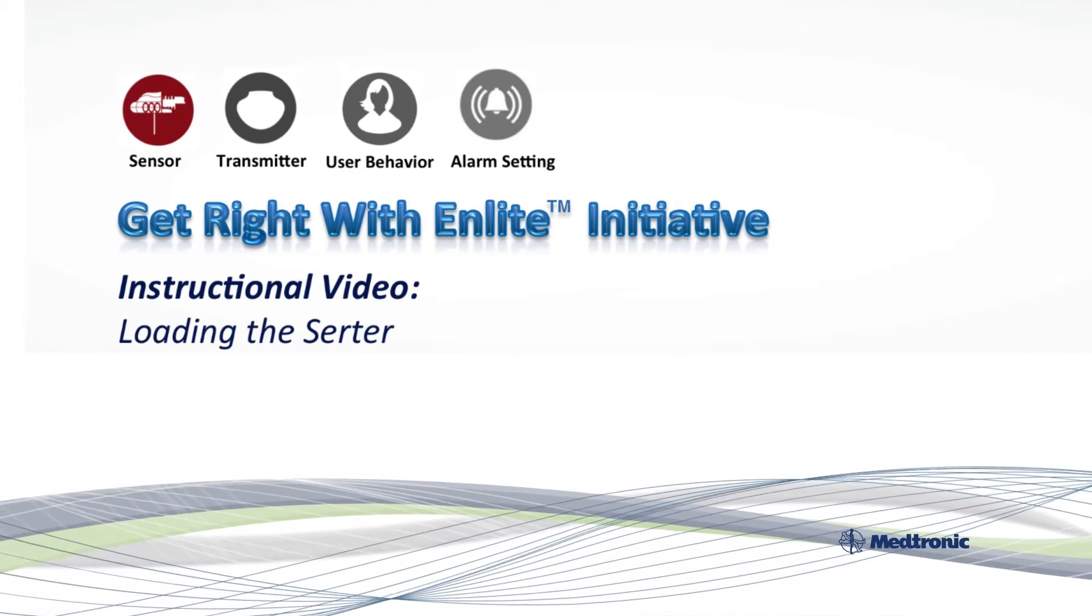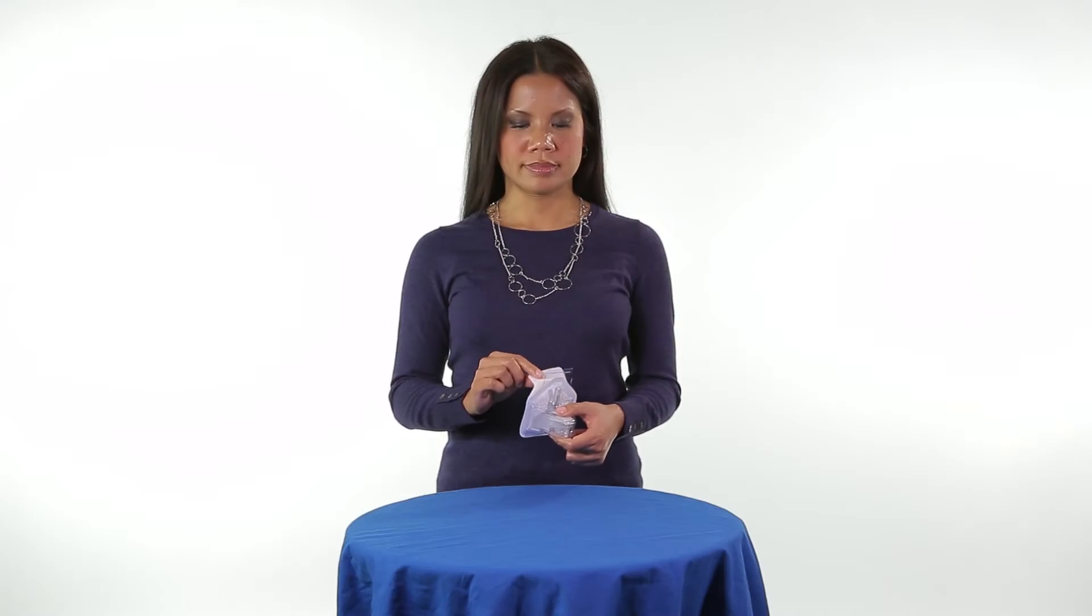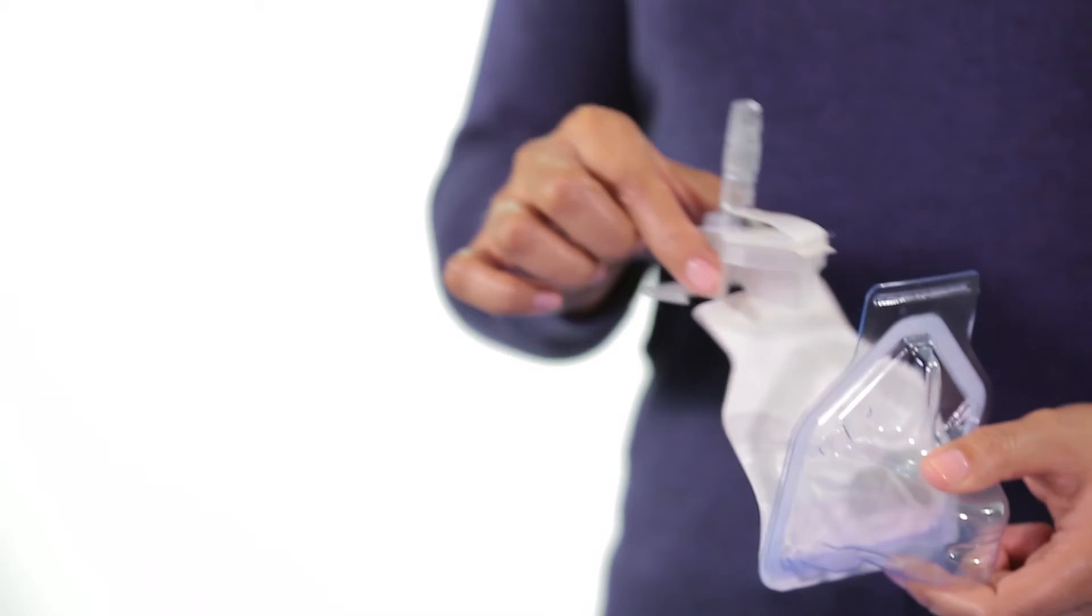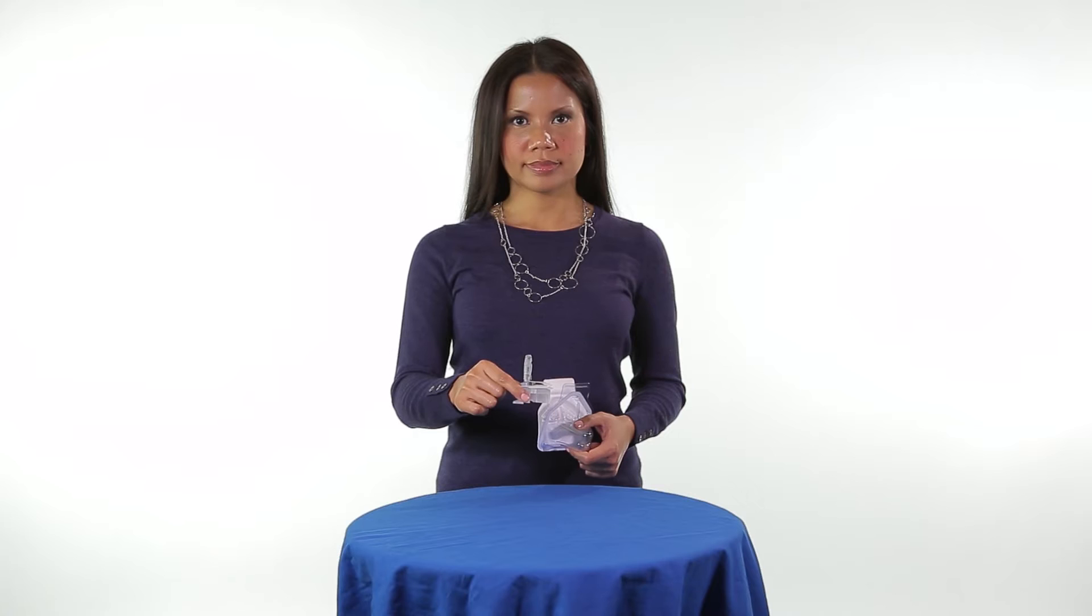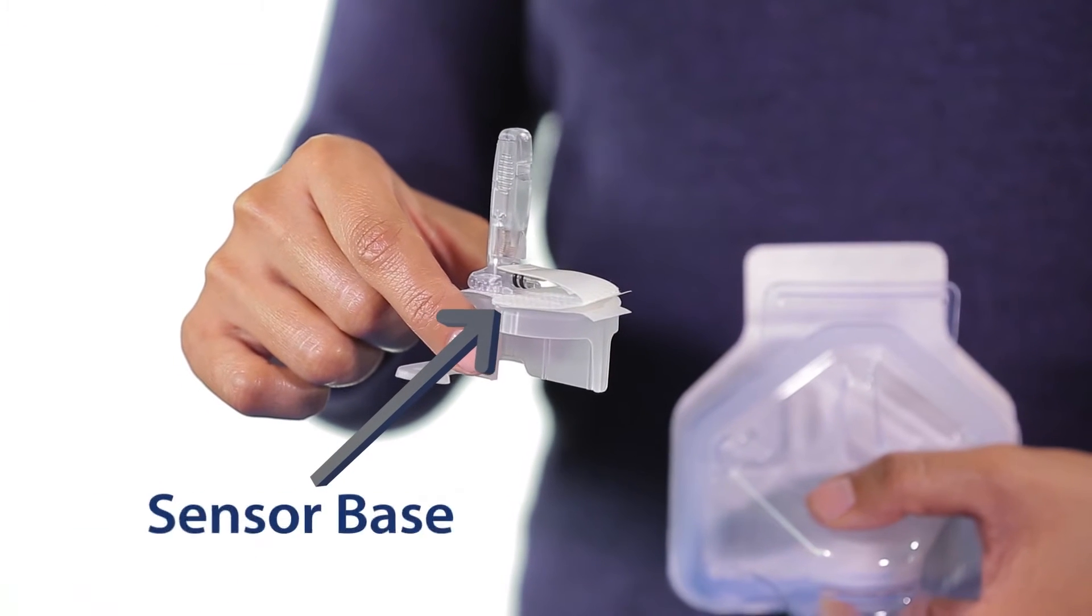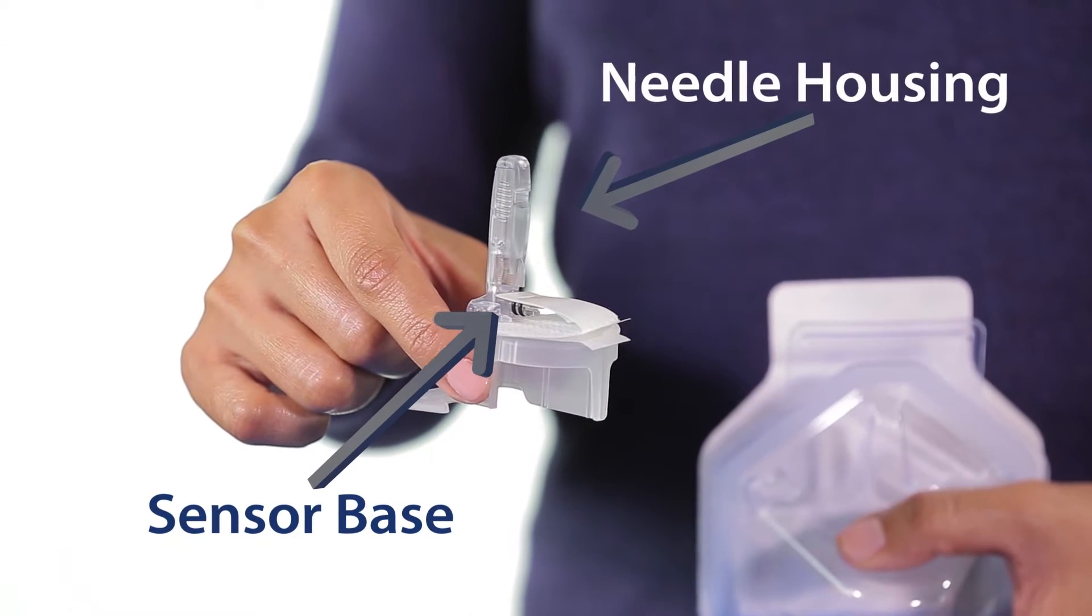Now let's talk about loading the sensor into the Serter. When removing the sensor from its packaging, you should hold the sensor by the plastic pedestal only. It is important that you don't hold it by the sensor base or needle housing, as this could damage the housing.